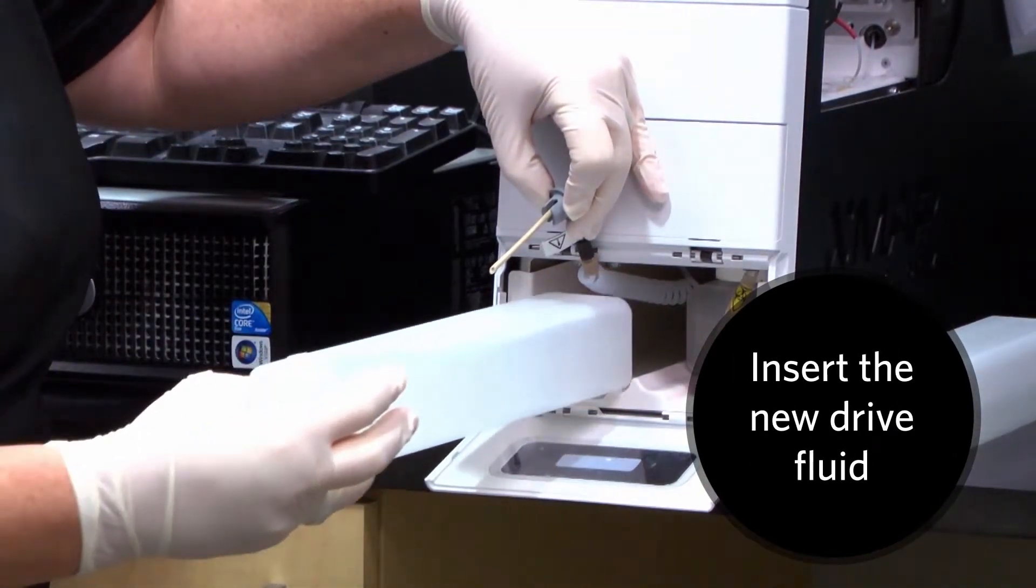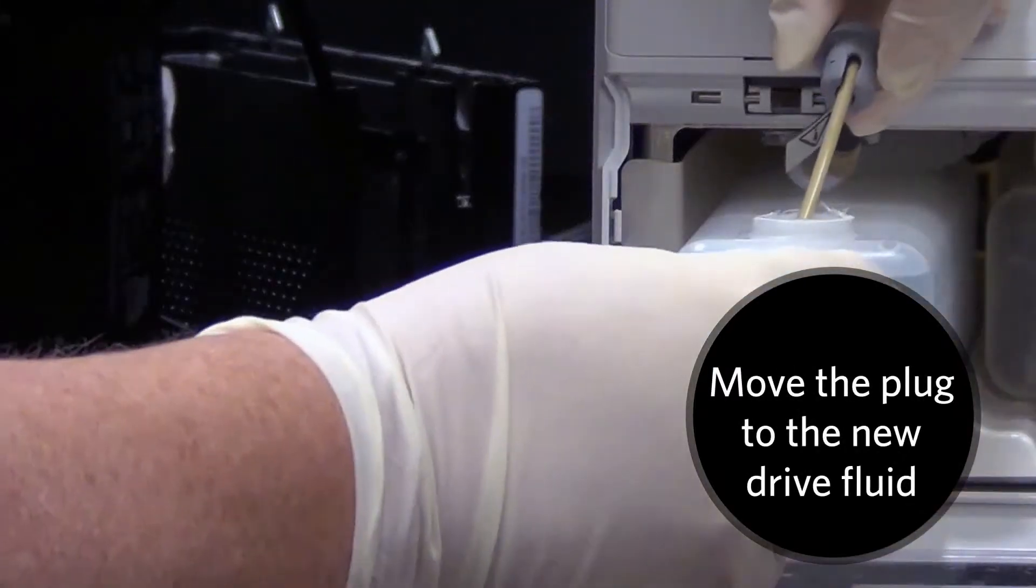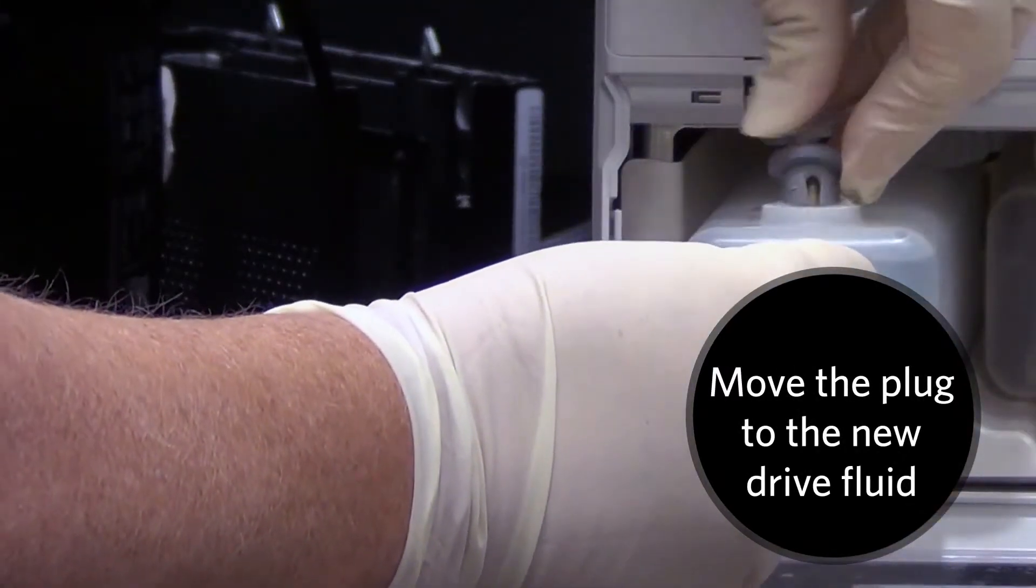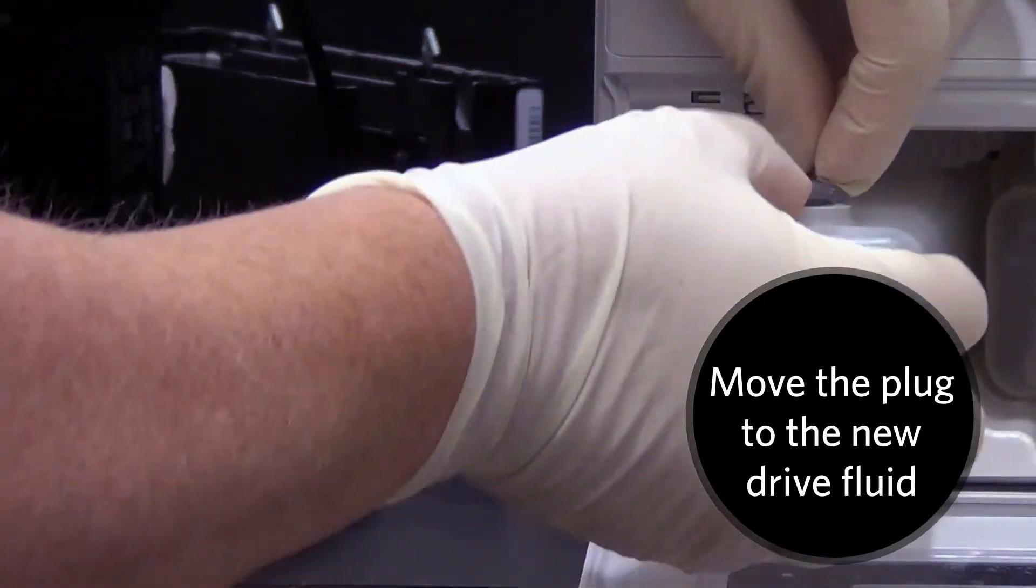Insert the new dry fluid container part way into the fluid compartment. Connect the tube and plug to the opening on the top of the new dry fluid container.